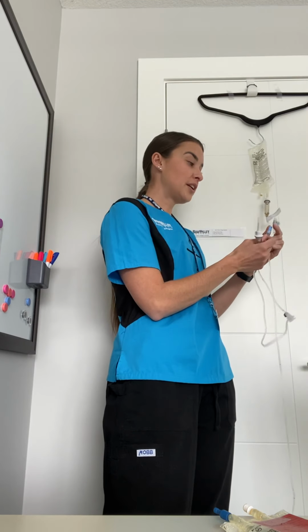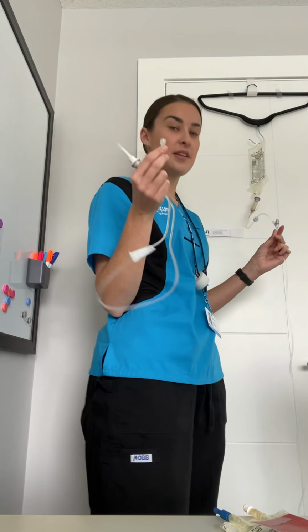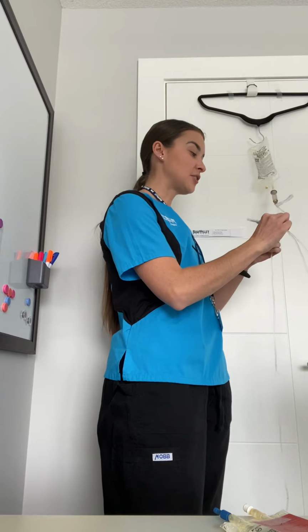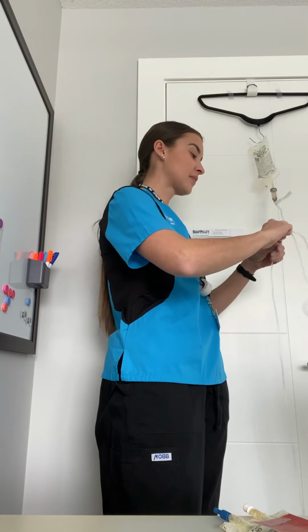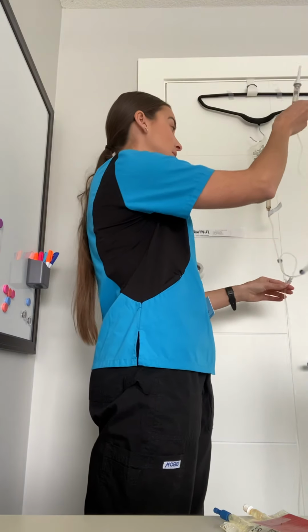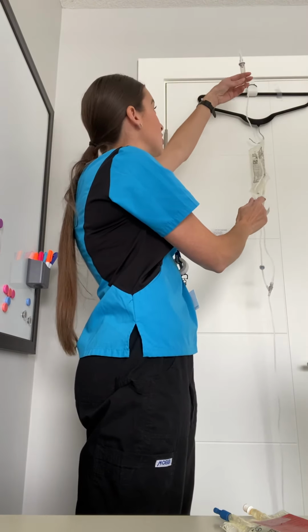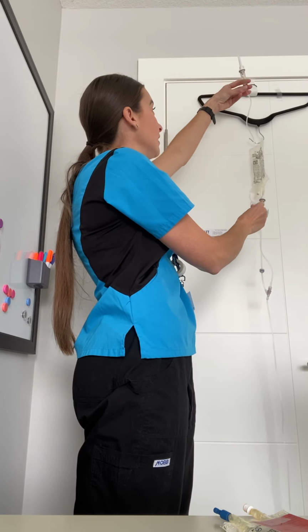What we want to do here is undo this little blue cap from the secondary line and keep this sterile so we can connect the two lines, okay? So once we have that connected, we want to make sure that we're priming the line.